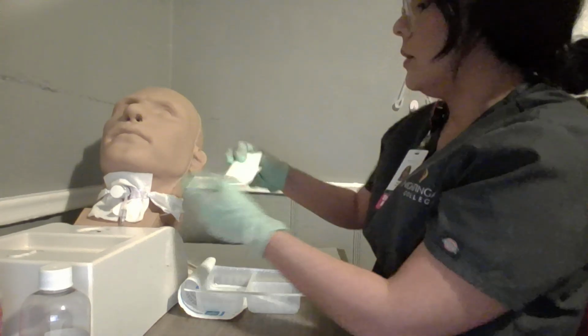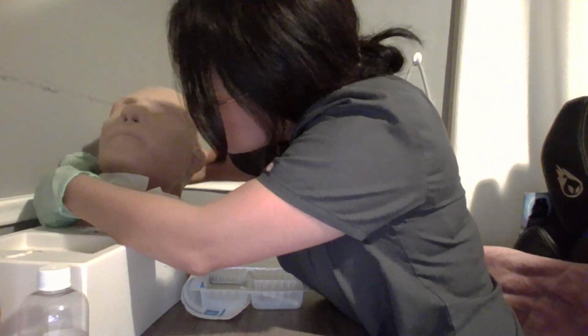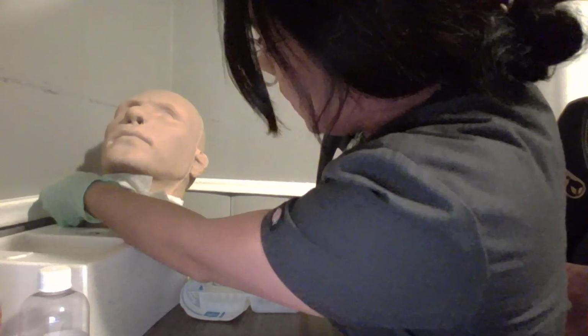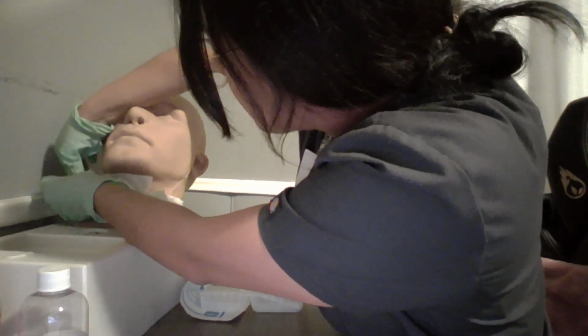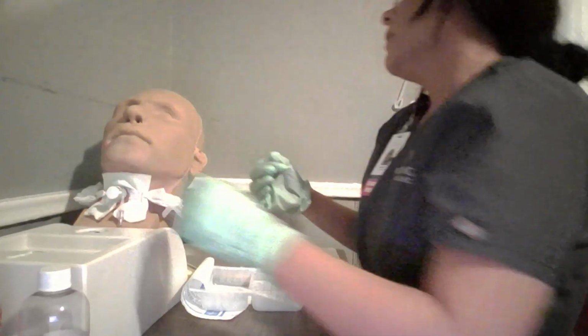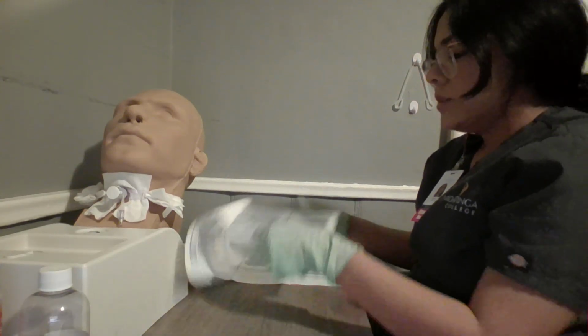Do the same to the other side. And do the same with the tape. Now that I'm finished with my sterile field here, I will discard all of my supplies.